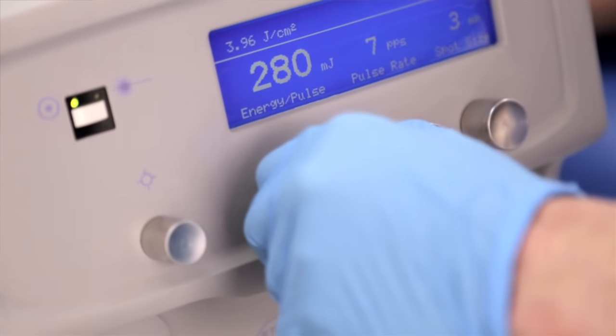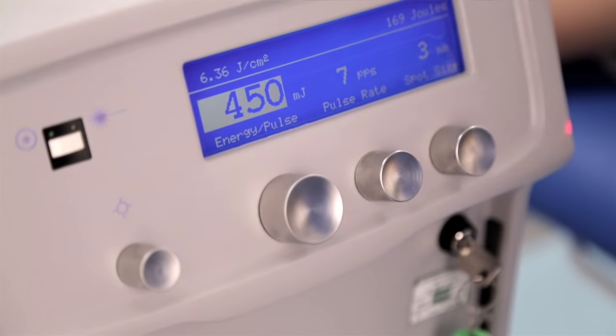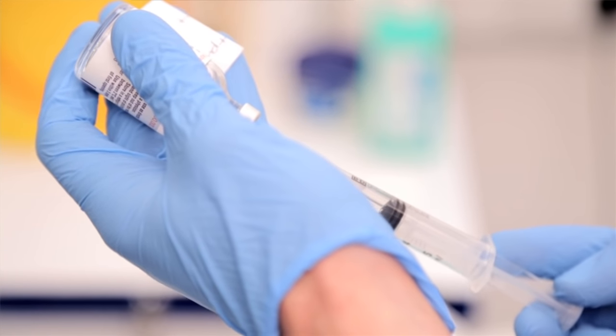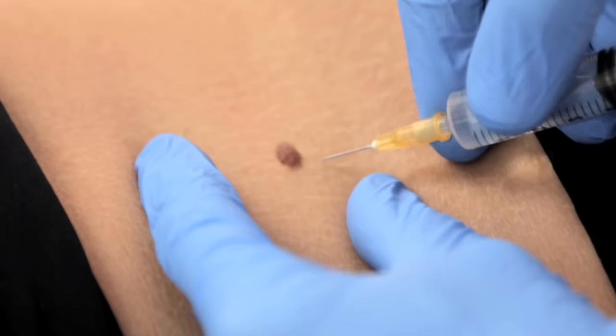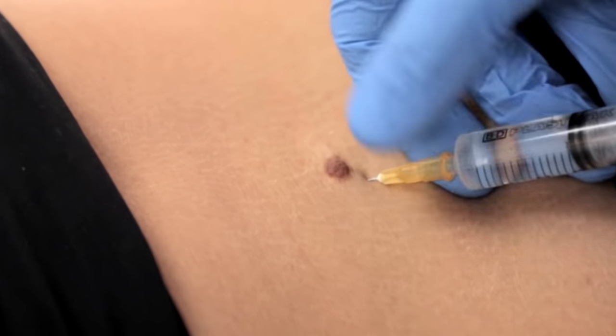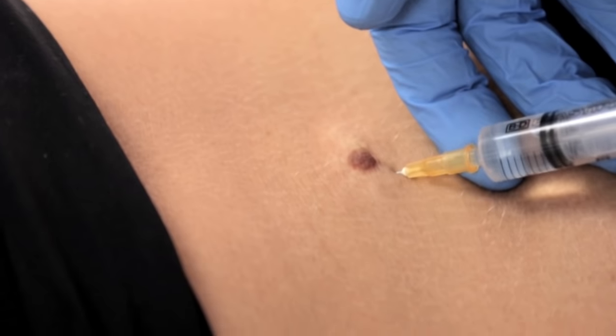Today we're going to use the Erbium Yag laser, which is excellent at vaporising the mole, leaving a minimal scar. First of all, we're going to anaesthetise the area so that the procedure is completely painless, and then proceed to remove the mole with the laser. Then we can talk through the aftercare, which essentially involves putting a dressing over after the procedure is finished.